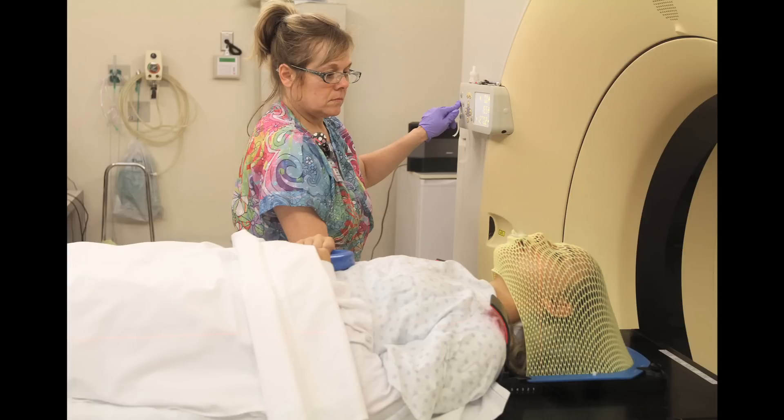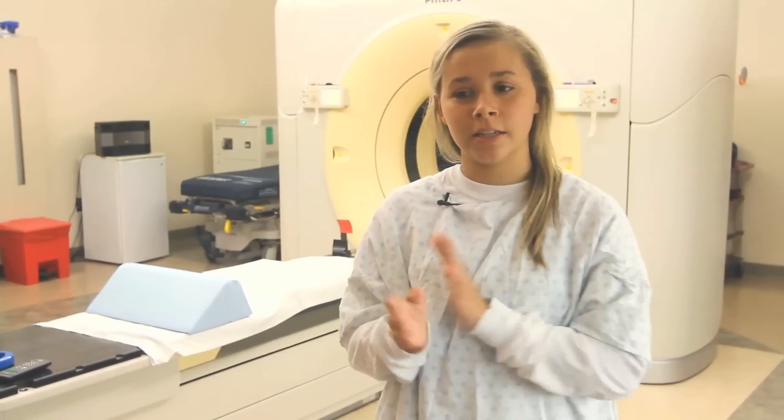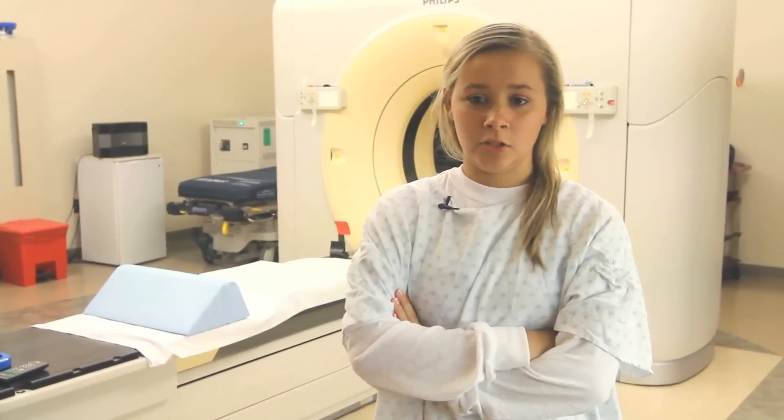I came in here and they put on some music. I laid down and they put a mask on me. I was scared at first, but when they put it on, it tickled a little bit — it tickled my face — and then I just went to sleep.